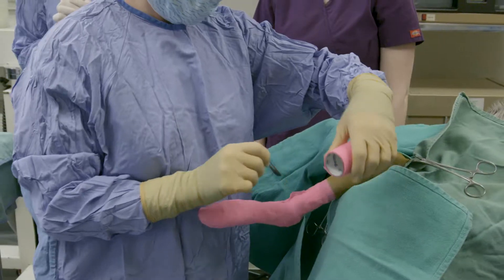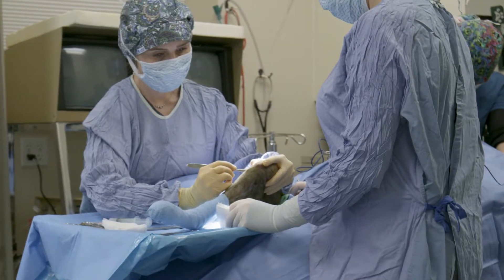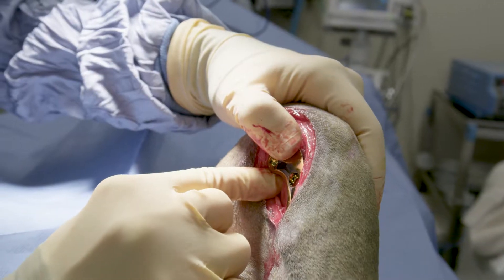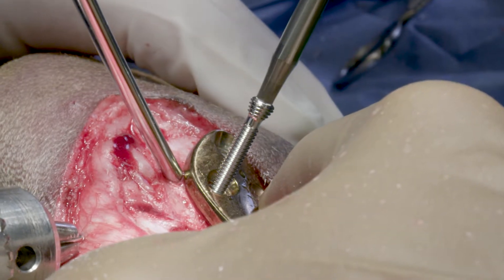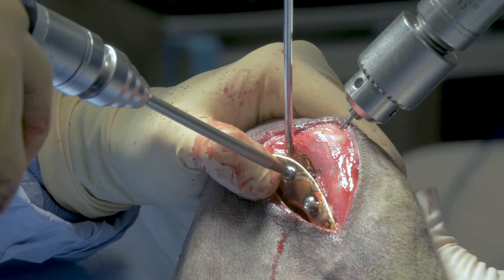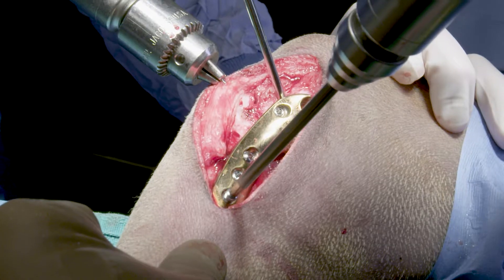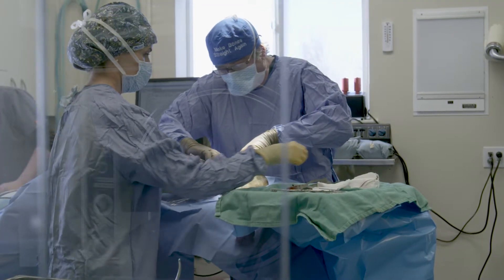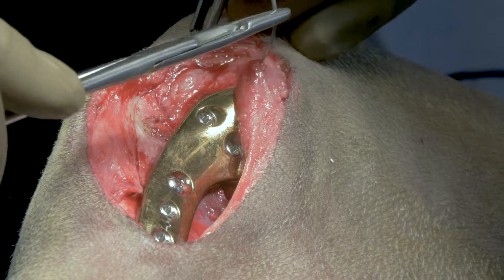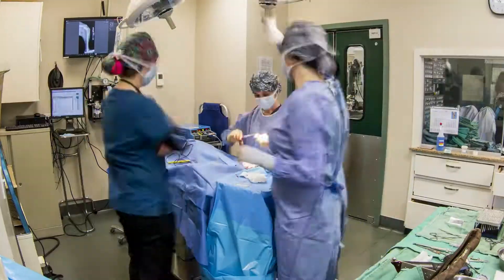Patients are in and out in one day. The procedure takes anywhere from 25 to 50 minutes depending on what needs to be done. With the TPLO curve plate, we have built in a number of design features to make it very solid. It uses axial and linear compression so if we jam the bones really solidly together, it doesn't matter if the dog jumps or chases the cat. The plate fits nicely to the bone, has an antimicrobial coating, and the screws lock into the plate — which is part of the reason for our high success rate.